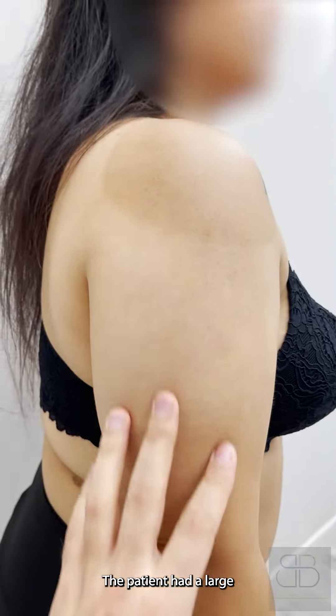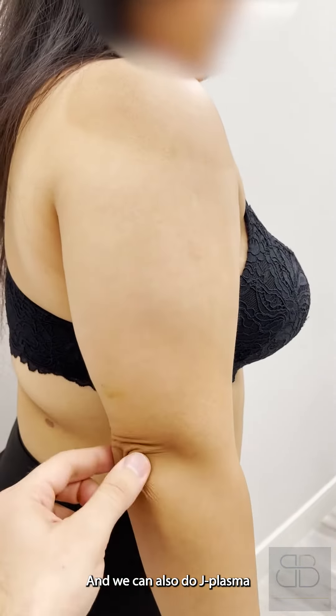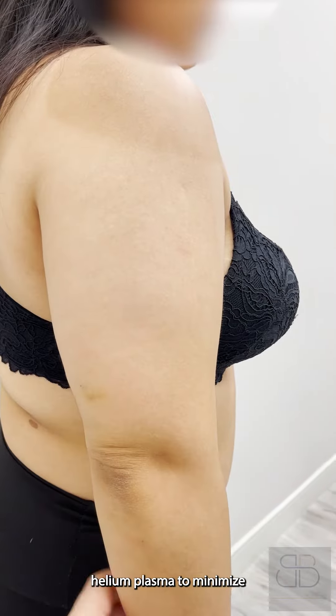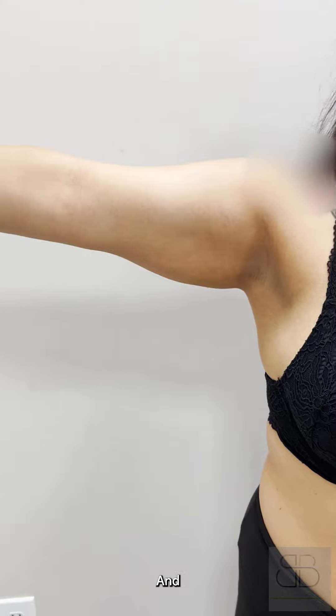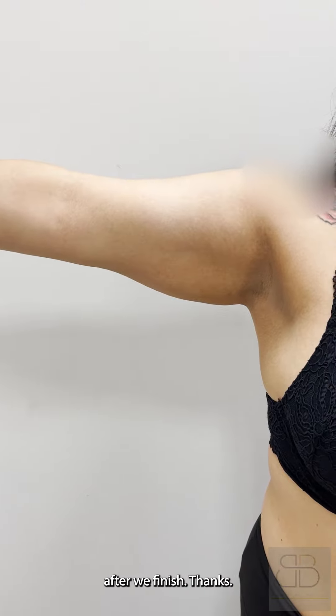The patient had a large volume here, and we can also do J plasma — helium plasma — to minimize the skin laxity. We'll show you the result after we finish.